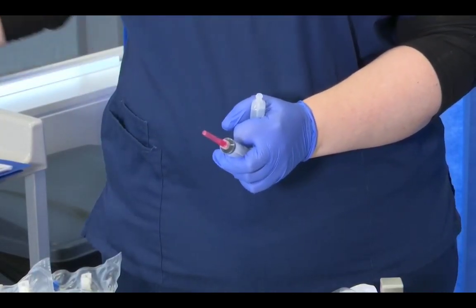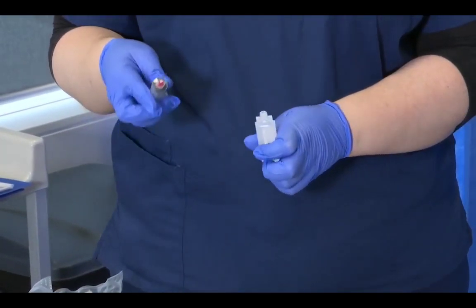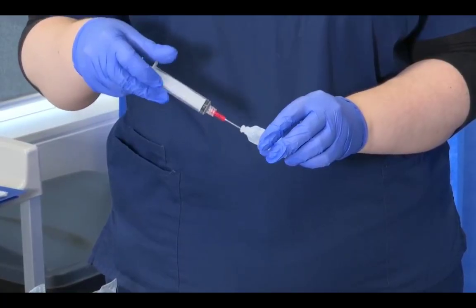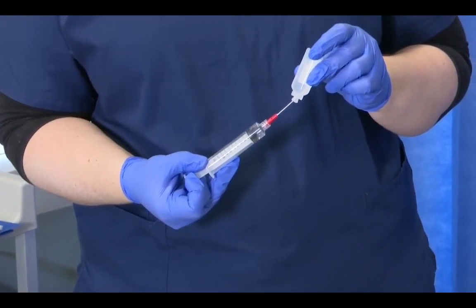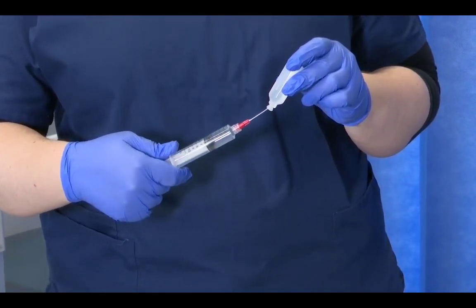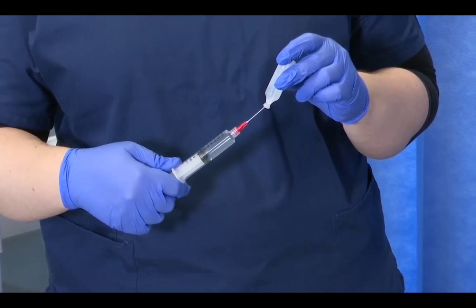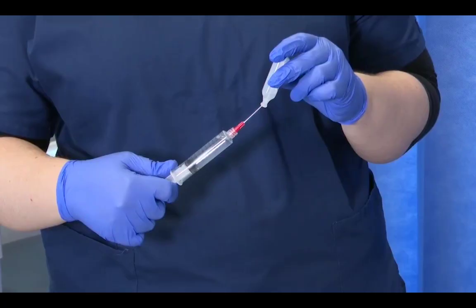Screwing the top off the ampule, we take the cap off our needle and place it in our blue tray, and then straight in, ensuring as we draw the fluid up, our needle is always below the water. We can't inject air into this ampule because it will ruin the surface tension and push the fluid out.